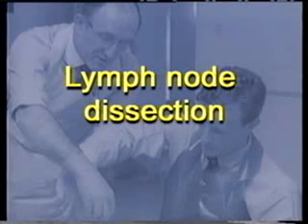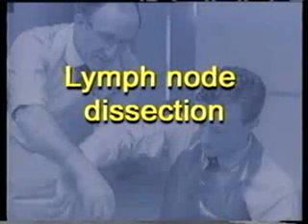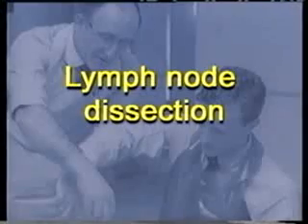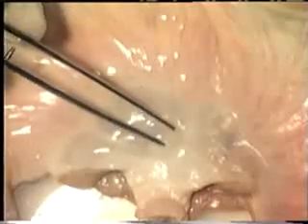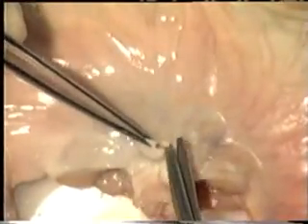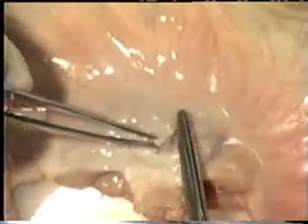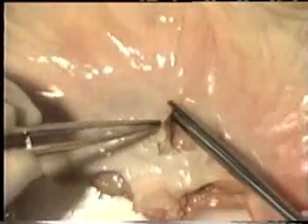If your specimen contains significant lymph nodes, and if time allows it, practice your dissection skills by removing one of the lymph nodes as demonstrated in the following section of video. A lymph node biopsy is often required in different situations, and using the small bowel provided, a lymph node in the mesentery will be dissected out to demonstrate some of the principles.